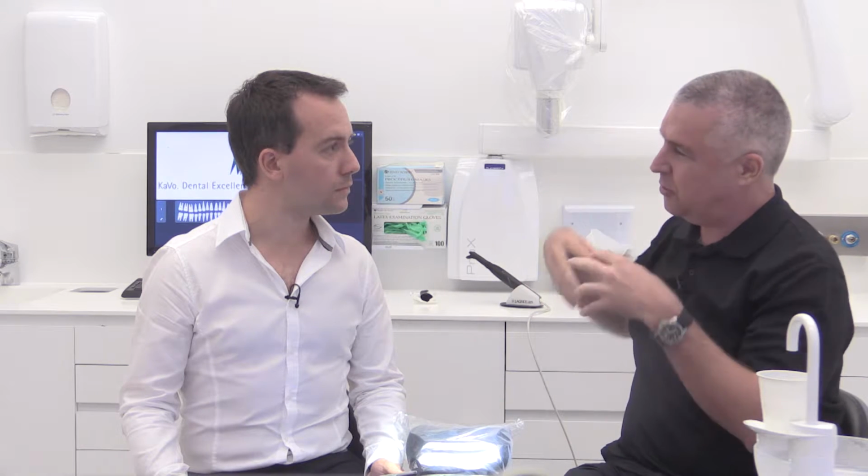They're both lasers, but one is using fluorescence light produced by, in this case, bacteria. That's DIAGNOdent. The DIAGNOcam is using light that's being shone through the tooth and back up into a camera. So it's probably easy to think about it like a really sophisticated intraoral camera that gives us a 3D view of the world that we're working in. But in contrast with a standard intraoral camera, the wavelength is much more telling. So essentially, what is it that we're seeing through the DIAGNOcam that we wouldn't see with an intraoral camera?